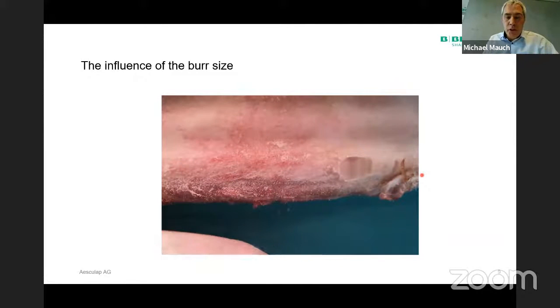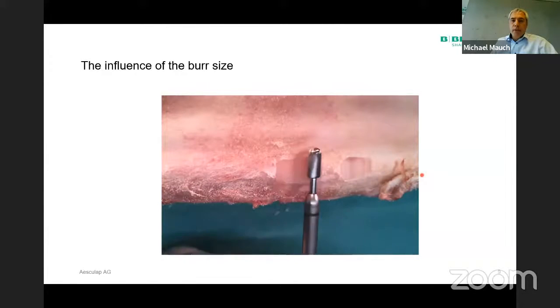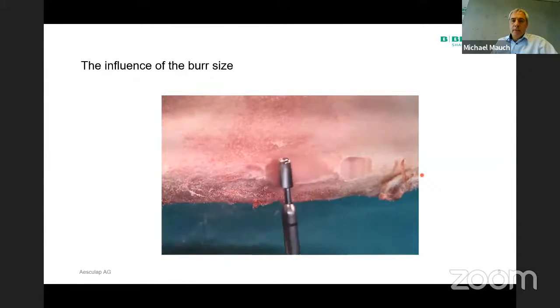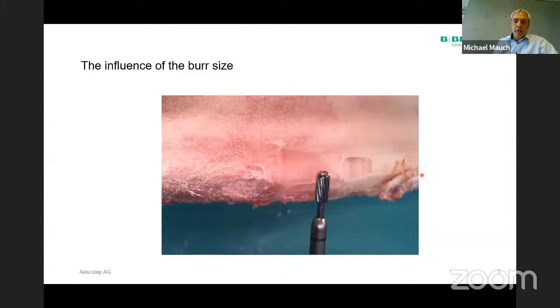Now, if you take a burr which is just 1 millimeter larger, so here it's a 5 millimeter burr, you will be able to do this much better. It is no problem to make that smooth surface. Now, in this special case, we even have used a soft cut burr, which is not that aggressive, and then you can do it even better. So always make sure you know what kinds of burrs are available. Sometimes it's not the most aggressive, but these soft cut burrs which are available can do the job in a better way.